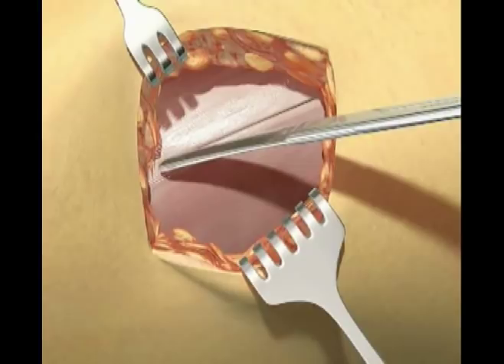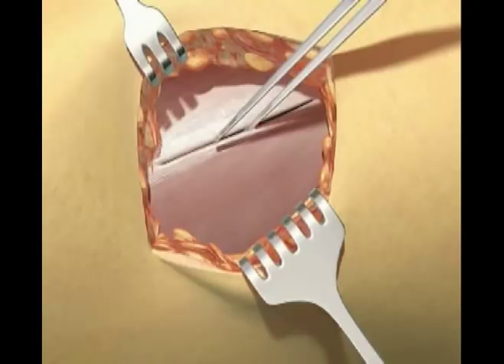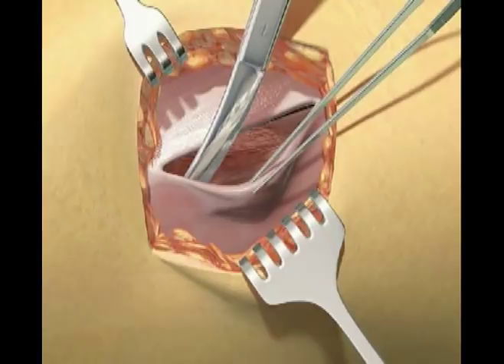The femoral cutaneous nerve is ventral to and well away from the exposure. With the fascia exposed, palpate the underlying plane between the tensor fascia latae and the iliotibial band. It is here that the fascia is of sufficient thickness to allow closure at the end of the procedure. Use scissors and blunt dissection to separate the tensor fascia latae ventrally from the fascia, following the plane of incision down to the capsule of the femoral neck.